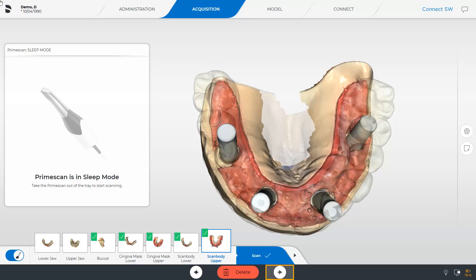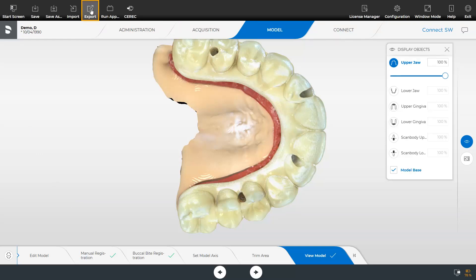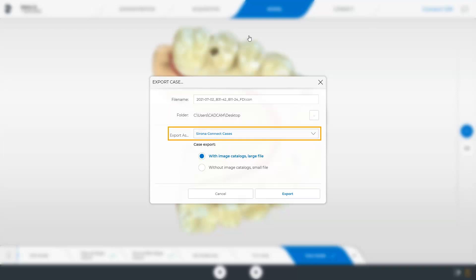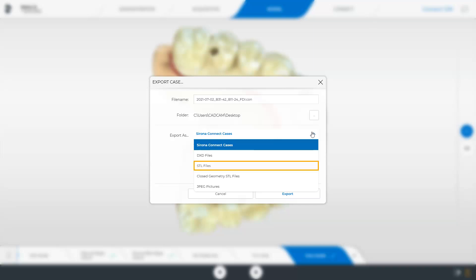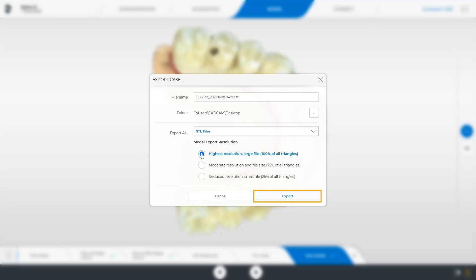We now switch to the model phase so that the virtual models can be calculated. At this point, you have the option to export the OpenSTL dataset to an external storage medium. For this purpose, we open the System menu and tap Export. You can change the file name and select the storage location before defining the desired export format. We select the STL files option with the highest resolution. This file type can now be transmitted to your partner lab. By tapping Export, the process is started and you will receive a separate STL file for each image catalog. In our case, we will transmit the data via the Connect Case Center and therefore click Cancel.